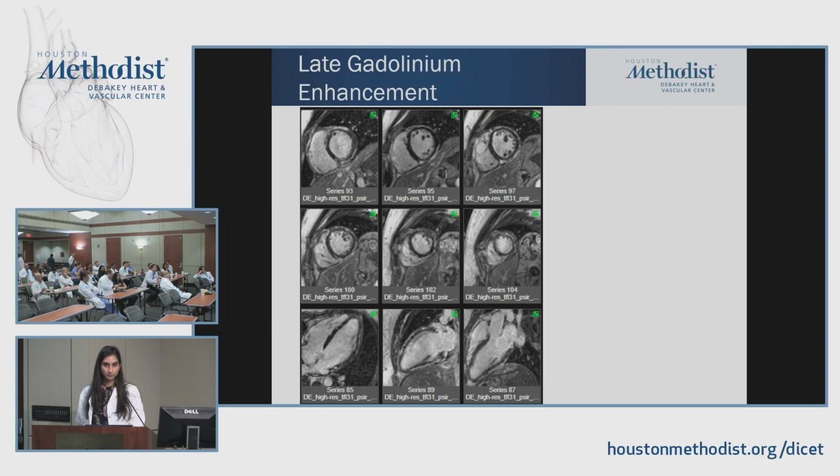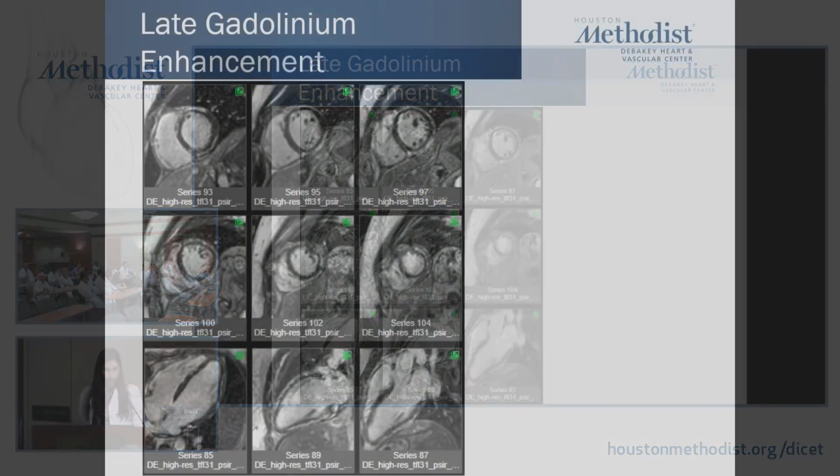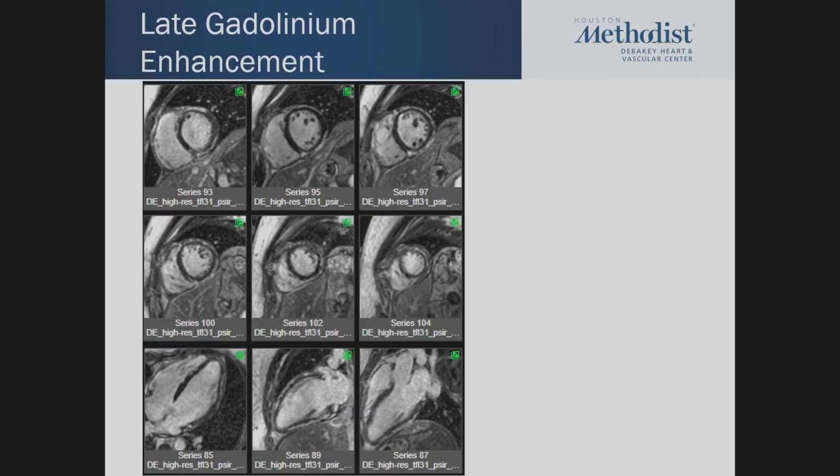So where we were looking earlier, well, first of all, I do see some late gadolinium enhancement. And to me, looking from base down to the apex, it looks like I see some in the anterior wall. If you look at the top left, yeah. And so just to refresh everyone's memory, normal myocardium is going to appear black, and anything where the gadolinium is interspersed is going to appear bright. And the pattern, first of all, I want to see how far down it goes. So I see it near the base, and I see it also in the anterolateral wall as well, from base even to the mid ventricle. And it looks like all the way down to the apex.